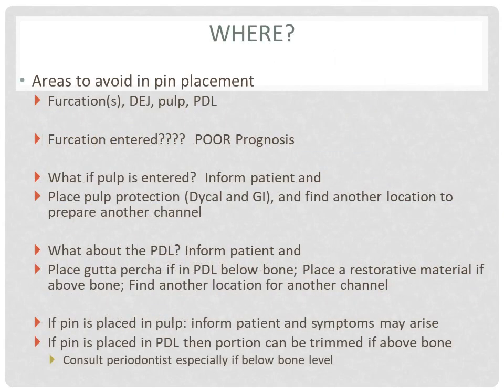When a pin is placed into a furcation or into the pulp, the tooth has a poor prognosis. If the pin channel enters the pulp, we would place Dycal and glass ionomer in the pin channel. Then, find another location for a pin.